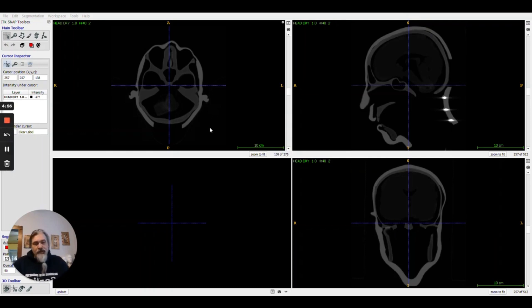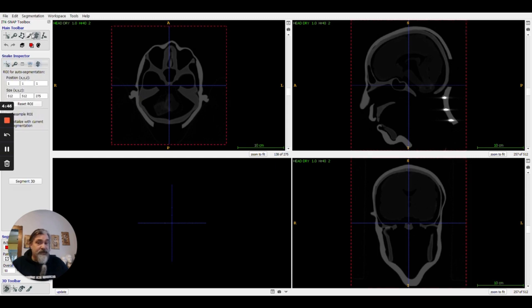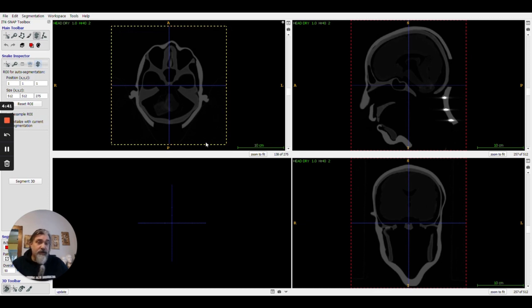I'm going to show you how to do segmentation using thresholding in ITK snap. You've got your model loaded and you can go to the segmentation tool. It looks like a snake or a money symbol. You can adjust the borders, however in this case I'm not going to, and you push segment 3D.